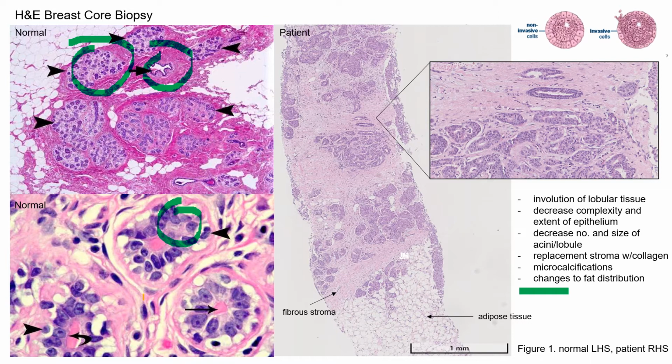Biopsy will allow for the determination of histological molecular cancer subtype, which has an implication on the prognosis and treatment options. Although there is one normal duct present here, as shown by the intact myoepithelial and luminal double layer, the tumor is still forming tubular structures, and outside of which we see disturbance to healthy ductal and lobular architecture, with solid masses of neoplastic cells obscuring duct lumens and invasion of tumor islands into adjacent stroma and fat tissue.